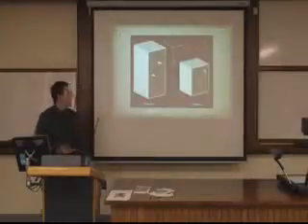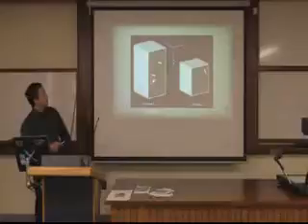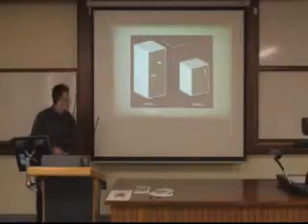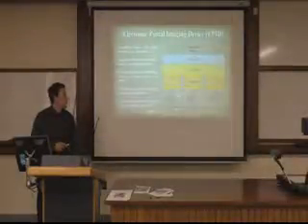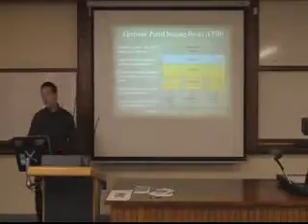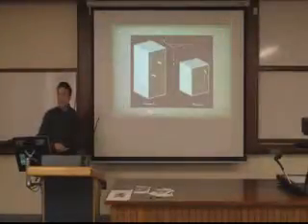And a couple of phantoms, there were 3 phantoms but I'm just mentioning 2 here, were constructed. These are made of just polystyrene blocks with gold fiducial markers in them. These markers are about 5 millimeters in length and 1 millimeter diameter. And the purpose of them is that the images produced by an EPID, because it's such high energy, Compton scattering dominates and they're very low in contrast, and they don't show soft tissue very well. And so fiducial markers can be used as surrogates for the actual target you're trying to aim for.